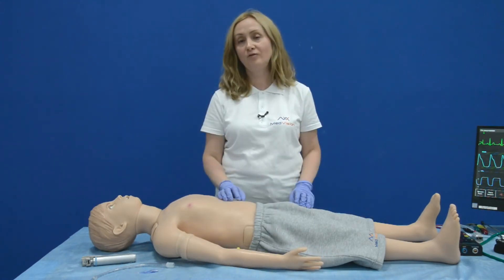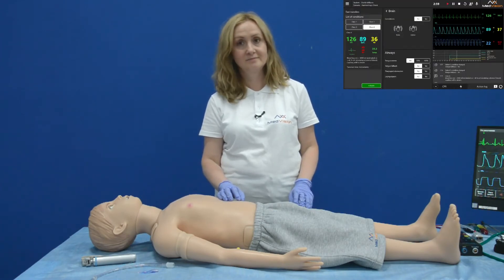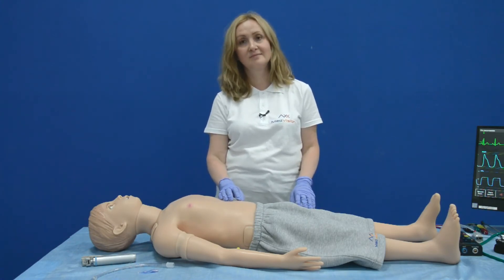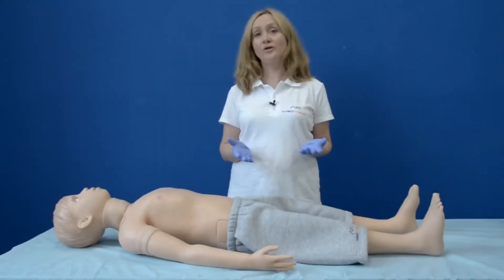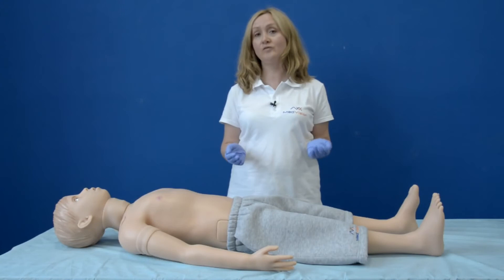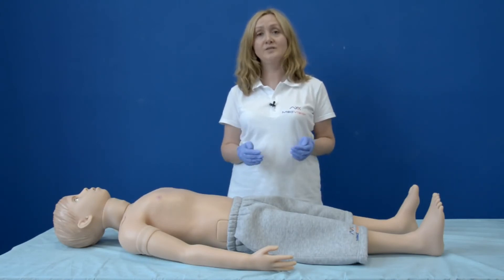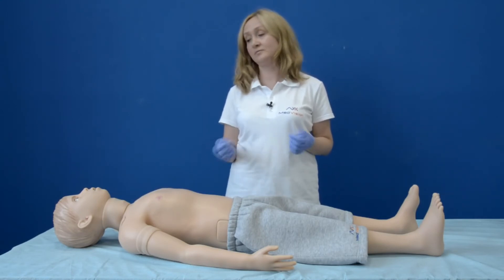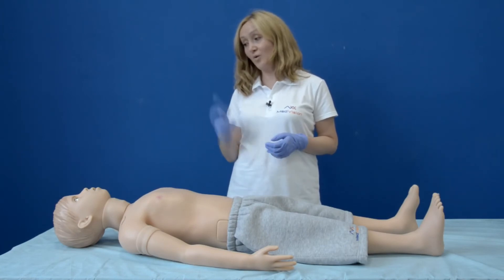One of the benefits of Arthur is that he can produce different types of convulsions — tonic and clonic — according to your case scenario. With Arthur, you can easily create patient-provider communication, as Arthur has a good library of preset phrases and sounds like screaming, coughing, and crying. For example: 'Arthur, how are you now?' — 'I'm good, better now.' — 'Wonderful!'